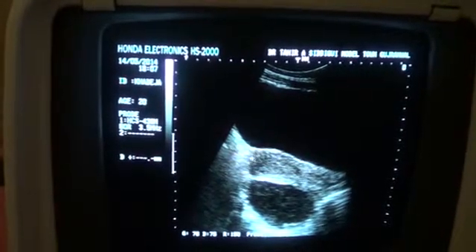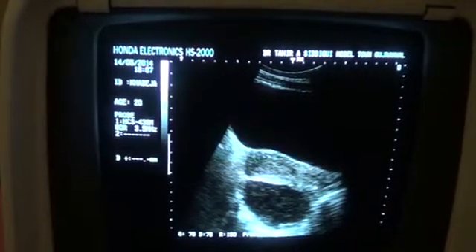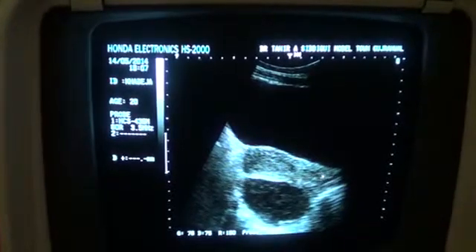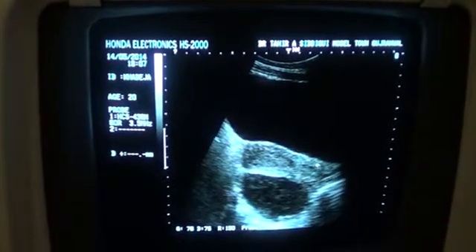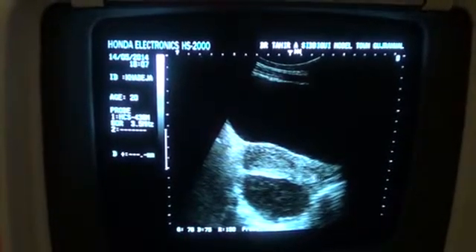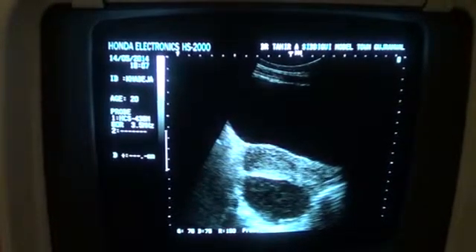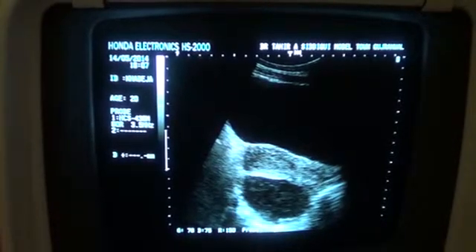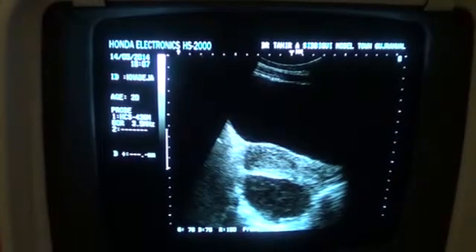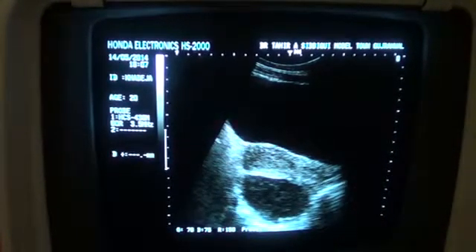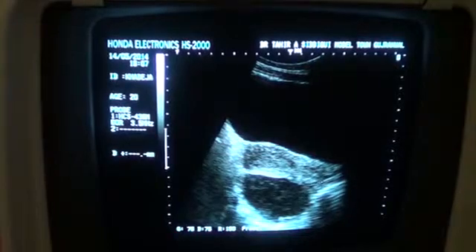This is the anterior myometrium, posterior myometrium, endometrial canal. This is the cervix. This is the cervical canal. And this is the posterior lip of the cervix.